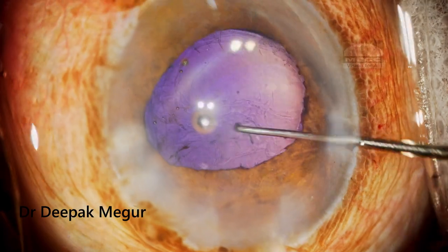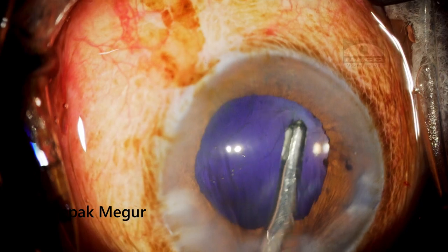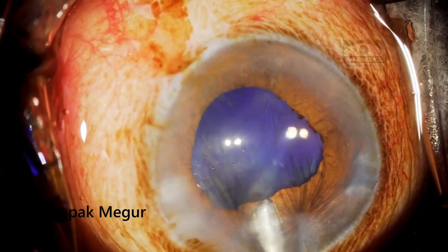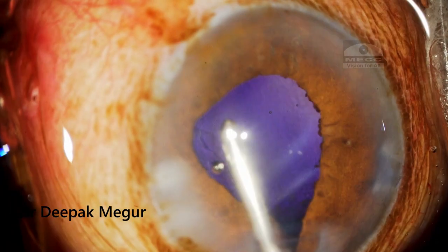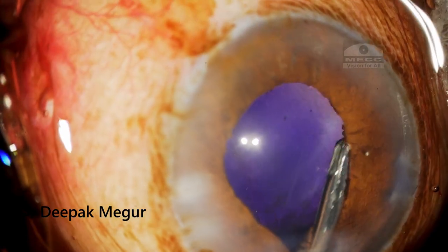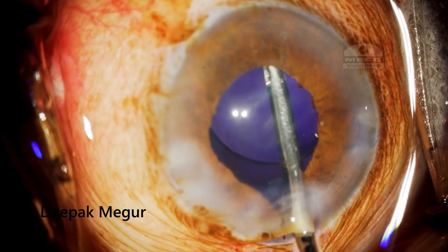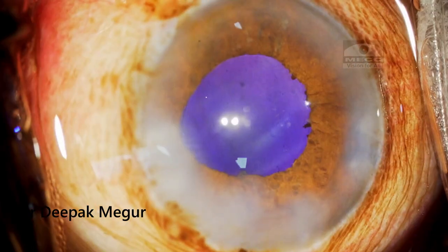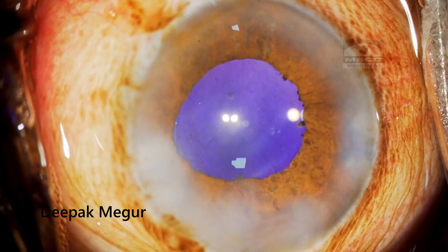In this case, we didn't have any issue with fluid misdirection or the AC getting shallow. The dye in the vitreous is a reminder that once fluid can get in, it can sometimes cause fluid misdirection — but in this case it was harmless. The absence of a red glow itself can be challenging since we are used to performing further maneuvers with a glow present. The lens was implanted without any issue. In the postoperative period, we should understand that it is innocuous — there is no effect on the retina, and the dye gets absorbed within about two days.